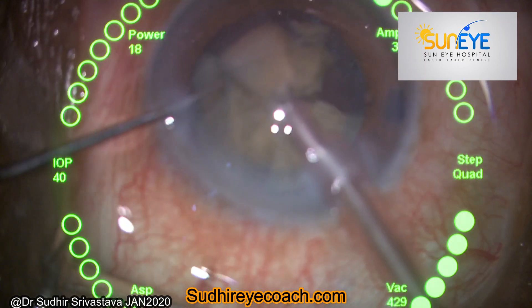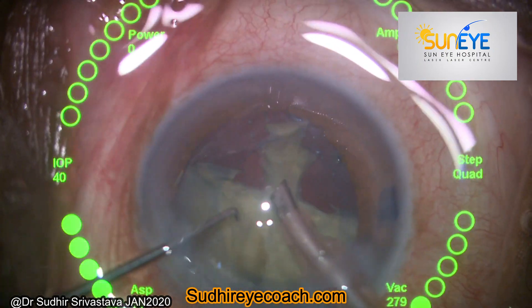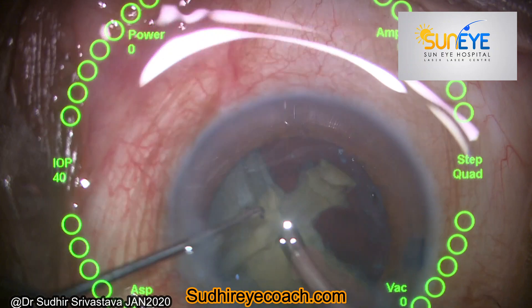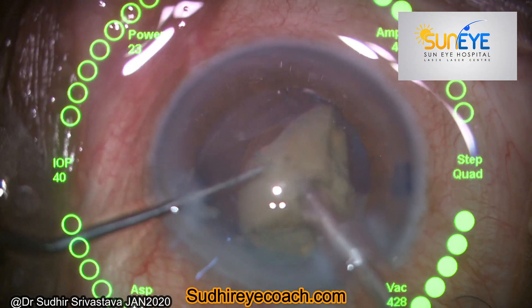Rotate the nucleus and make sure it is free. If it is not free, chop it and then bring it to the level of the iris plane, where you can finish your phaco fragmentation.